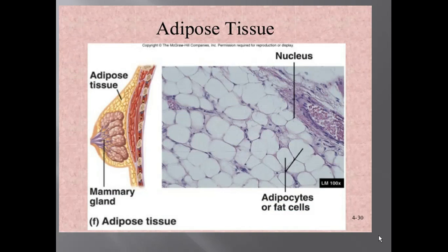Here we have adipose tissue, and you will see adipocytes are big or large cells with an eccentric nucleus and a narrow rim of cytoplasm. It's like flattened cells. The reason we have an eccentric nucleus, pushed to the edge, is because it's a storage of fat and storage of oil droplets. As for where exactly it is found, here I give a cartoon diagram for the breast.